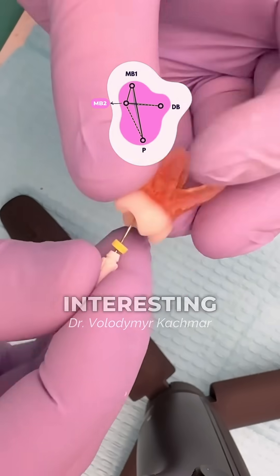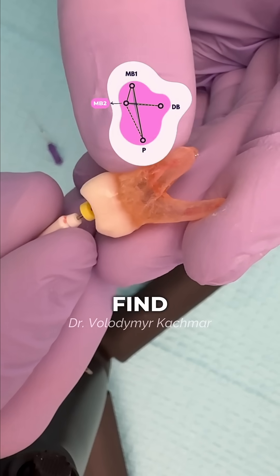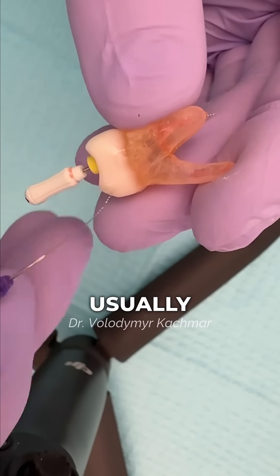Now for the most interesting part. MB2 is usually hidden between MB1 and the palatal canal. When you find it, be patient — especially at the beginning — since MB2 is usually really tight.